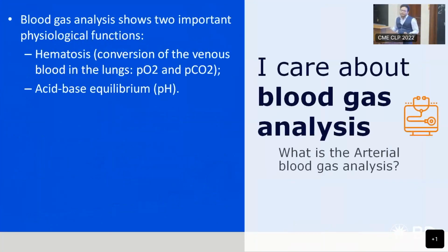Okay. So arterial blood gas collection, in the normal process, how are you doing it? Are you doing it with a pre-heparinized syringe or your own method? Many times we see that people are taking a normal syringe, flushing it with liquid heparin, and collecting the samples, right? So what we are trying to change is, I won't say promote, but we want to improve the process to pre-heparinized syringe arterial blood gas collection. There are a lot of advantages with this ready-made syringe. So that's what I'm going to talk about.